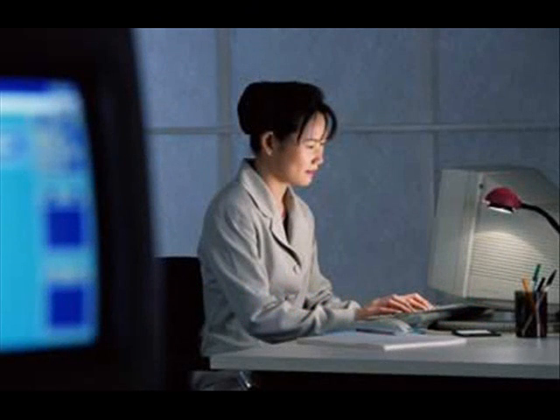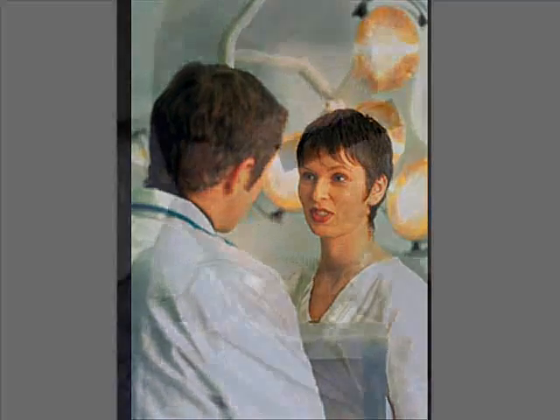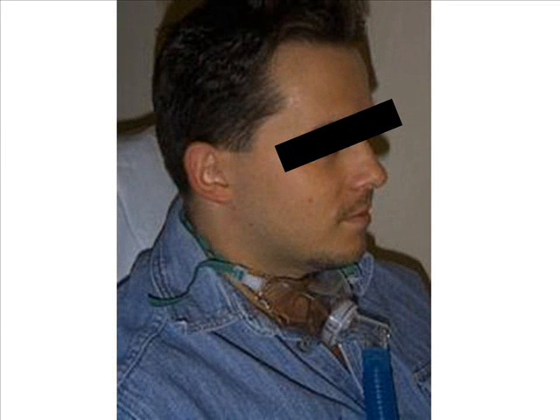Once returning the patient to their pre-assessment state, conclude the procedure and document appropriately according to your site policy and procedure. Notify other personnel as appropriate, including the preceptor to whom you are assigned.